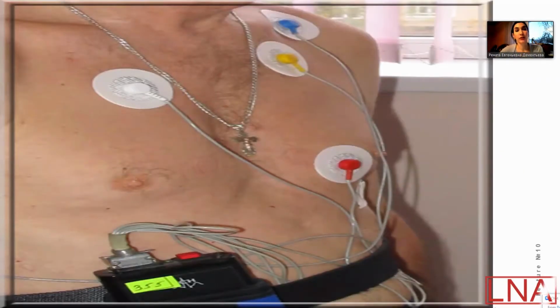It's just usually a way of putting on Holter monitoring. Look at the electrodes, with some not so standard points for electrodes. It depends on the type of these devices. In small devices, you should place it closer to these electrodes for a good connection between them, and put it and fix it, or for special devices, on the abdomen of the patient.